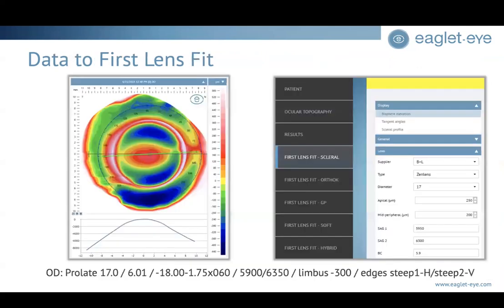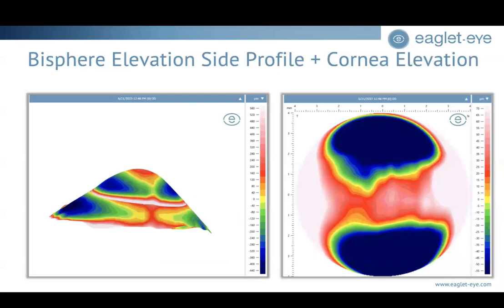Had we more carefully evaluated this shape prior to putting a lens on the eye, my first move would have been to decrease limbal clearance, because we know how steep and proud that central cornea is, and a lens on top of it is going to have excessive space at the limbus. That right there would skip a step.